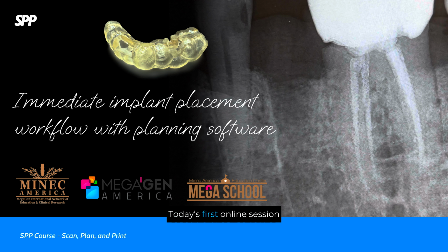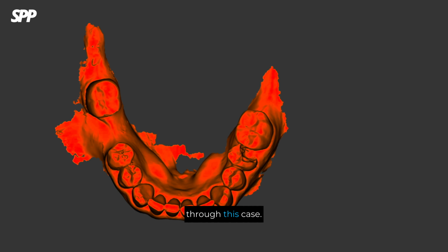learn. Today's first online session focuses on an immediate loading case. We will review how to plan the case in advance, prepare the prosthesis before surgery, and deliver it immediately after the procedure. Now, let's start. Let me walk you through this case.